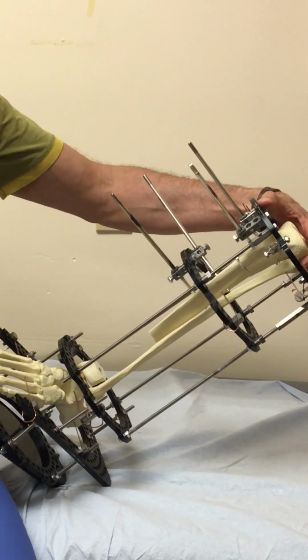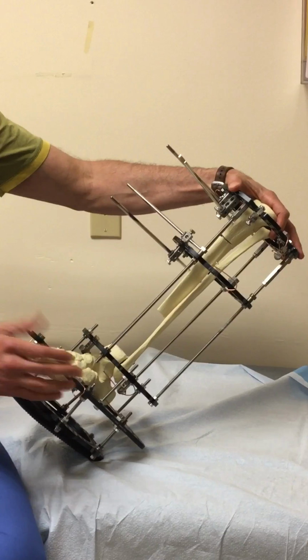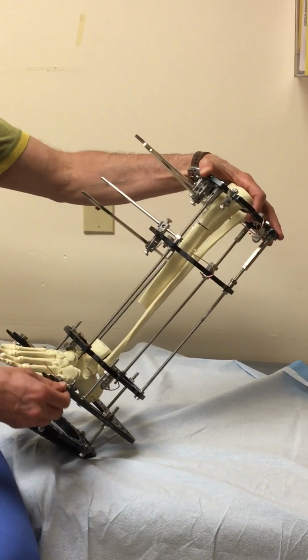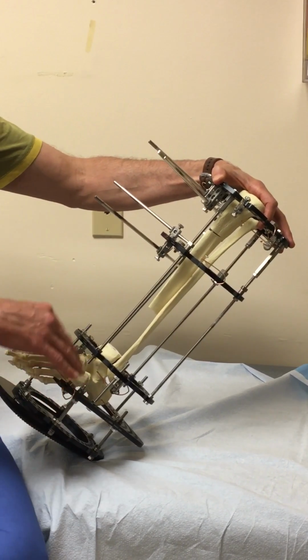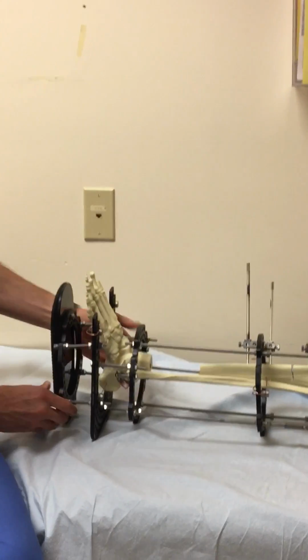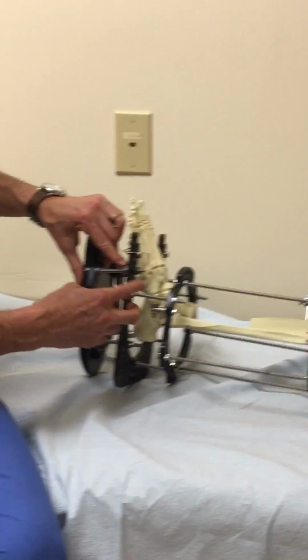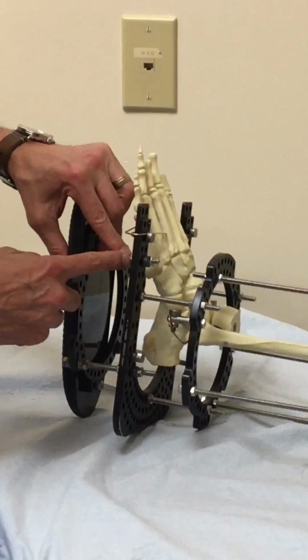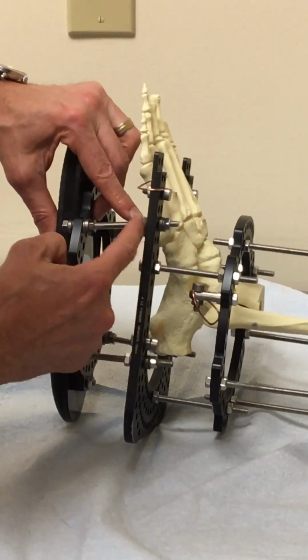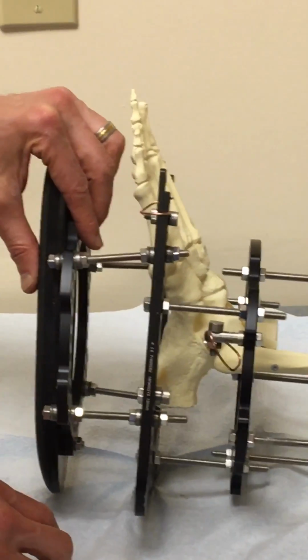So I'm sending you this model so you can take some pictures of it and you can sort of hold it and get to know it. And then my hope is that you can then take off the fixation into the sawbones. And then I'm just showing you, this is the foot plate. You would take off the foot plate. You want to zoom in or walk in? Yeah. So these are called conical washers, and they allow the threaded rods to angle a bit, all right?